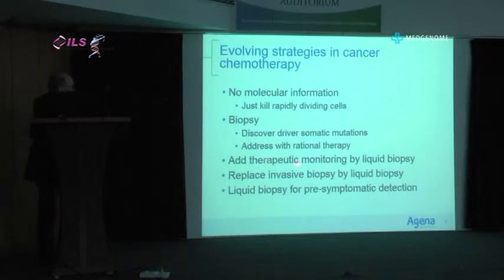Well, if we look in plasma, instead of looking at a sample of a tumor, in principle, we might sample all the versions of that tumor. And that's what I'm going to show you. And of course, measurements in plasma are non-invasive. We can repeat them as often as we like. If we're using mass spectrometry, they're inexpensive.